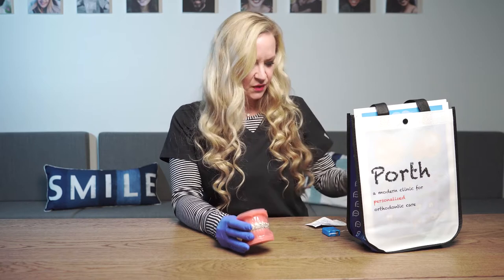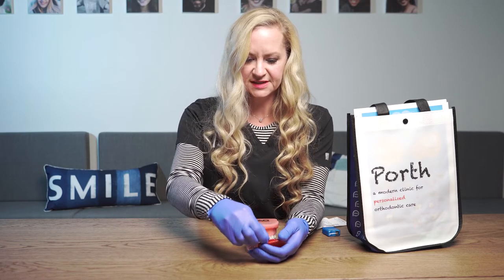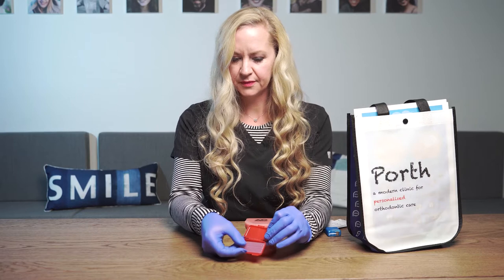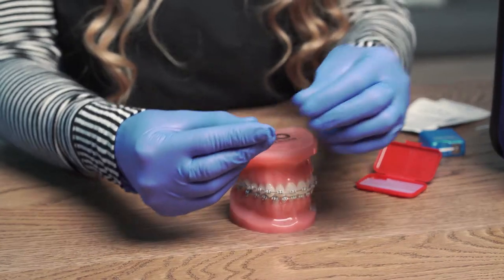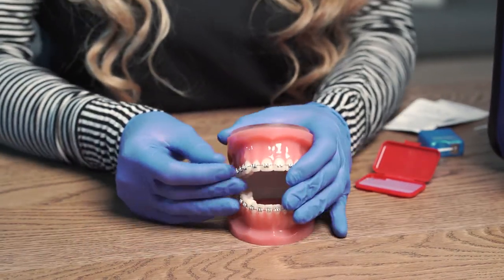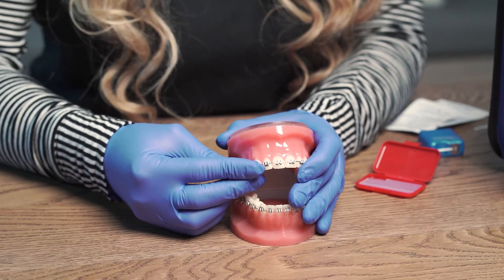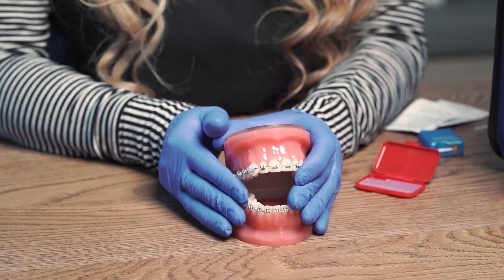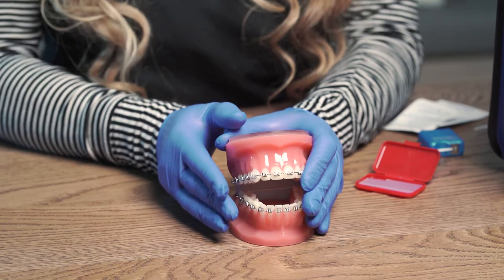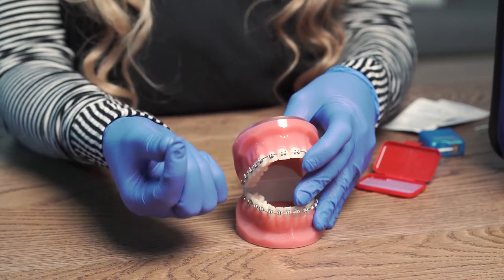The braces may rub and cause discomfort on the cheeks. We will provide you wax, which will come in little strips. Grab a small piece of the wax and roll it up into a little ball. If you have any areas that are rubbing and causing sores, dry the area off as best as you can, apply the wax on there, and gently mold it around the brace. That will make it more comfortable for your lip and cheek. To remove it, you can use a toothbrush or your fingers.